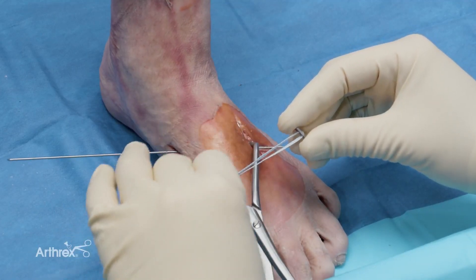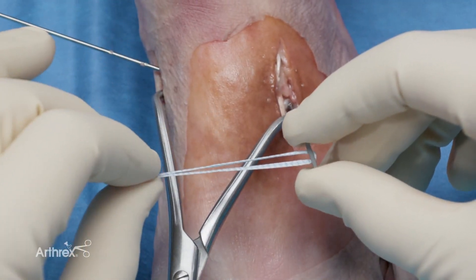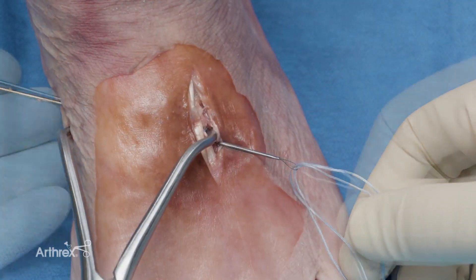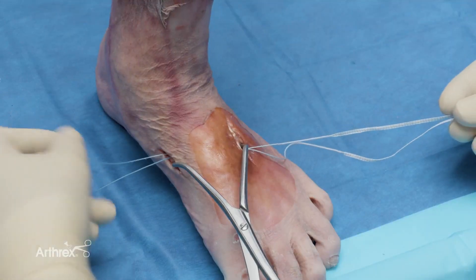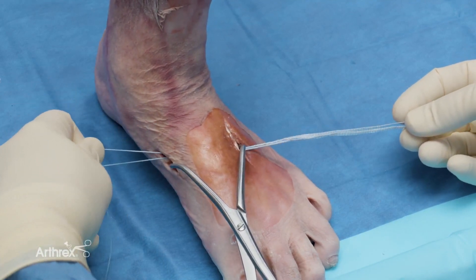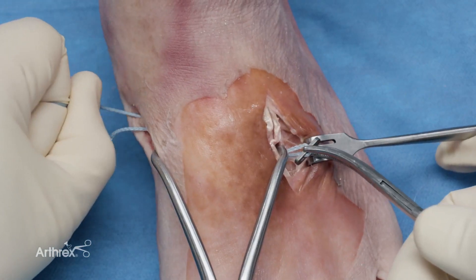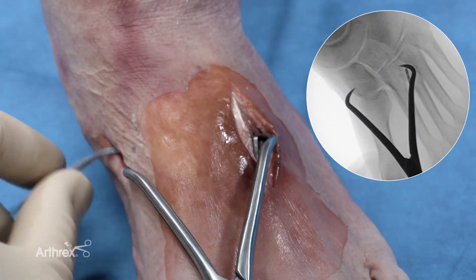Now it's time to pass the fiber tape and secure the button. It's important to make sure that your fiber tape aligns flush — you do not want any twisting, which might change the stability of the construct. I pass the fiber tape tips through the nitinol loop and pull them through. Once they are through, I make sure that they are not twisted upon each other, pulling them individually to ensure proper alignment. I have someone hold the button so it doesn't get twisted up. After oscillating between both limbs of the suture and sucking the button down, I get the button in position.